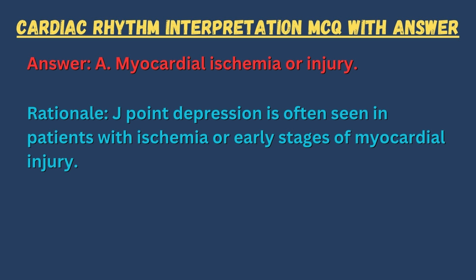Answer: A. Myocardial ischemia or injury. Rationale: J-point depression is often seen in patients with ischemia or early stages of myocardial injury.